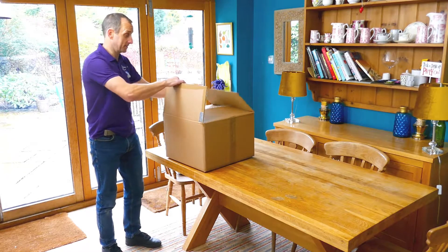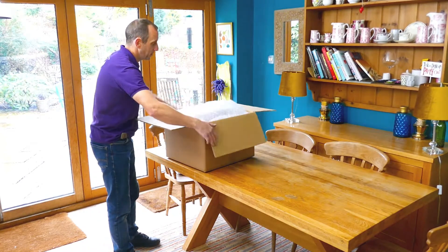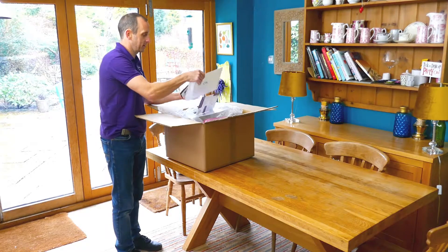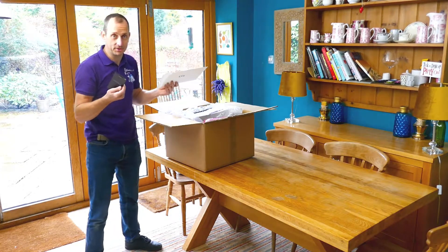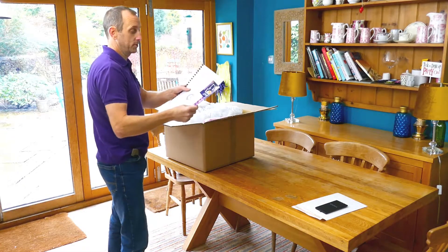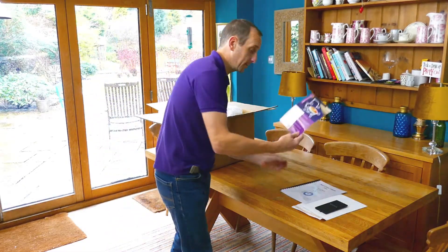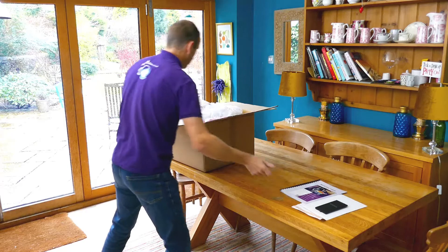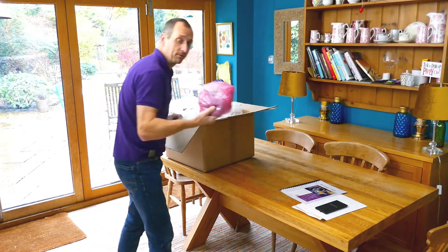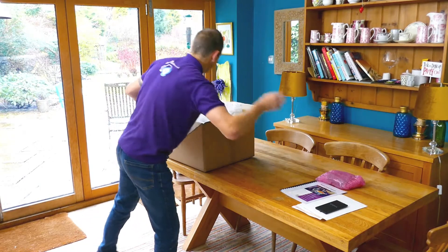Your Neater robot is ready to use out of the box. Once you've opened it and got underneath the initial packaging, you'll find an envelope with your tablet in, your instruction manuals, and a quick start guide which goes through in more detail what I'm doing now, and a power supply. The robot should be fully charged so you may not need that straight away.